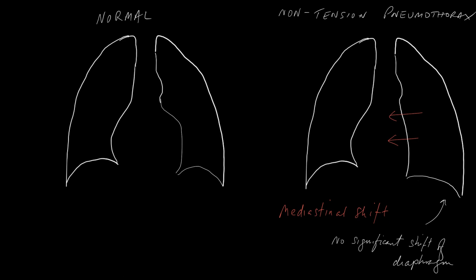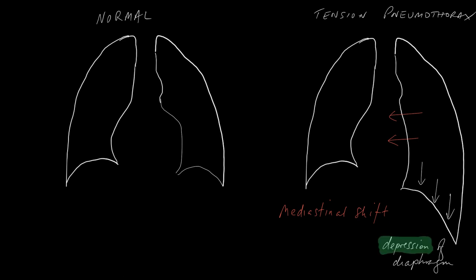In a non-tension pneumothorax, the patient has a collapse of the lung on the left side, there is some mild mediastinal shift, but the diaphragm is not really shifted. In a tension pneumothorax, the first thing that happens is depression of the diaphragm with all the other signs of pneumothorax. Eventually, because the pressure becomes so high, the diaphragm is everted — so instead of being concave downwards, it's now convex downwards.